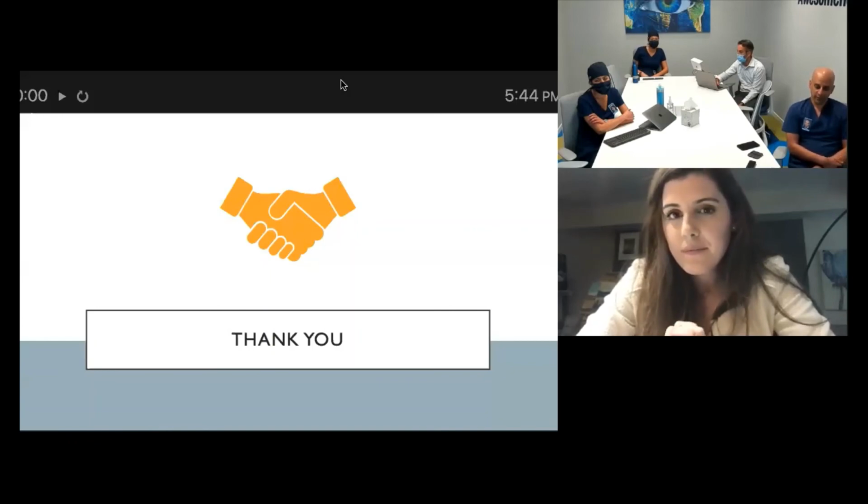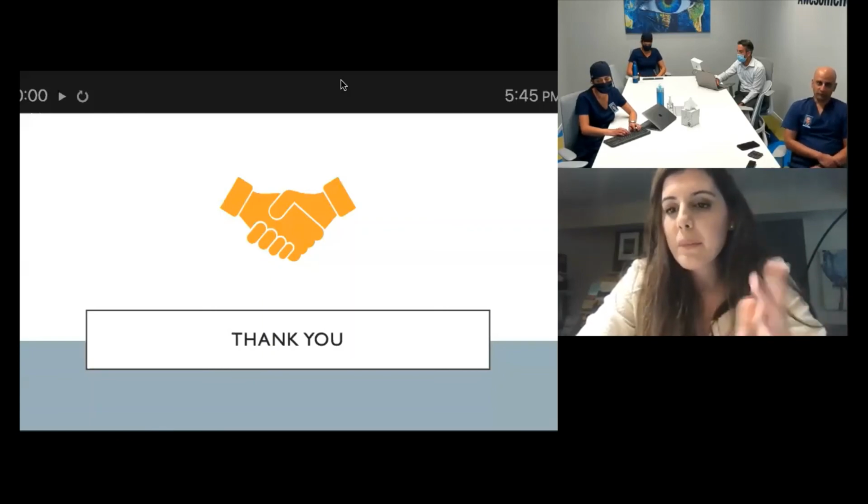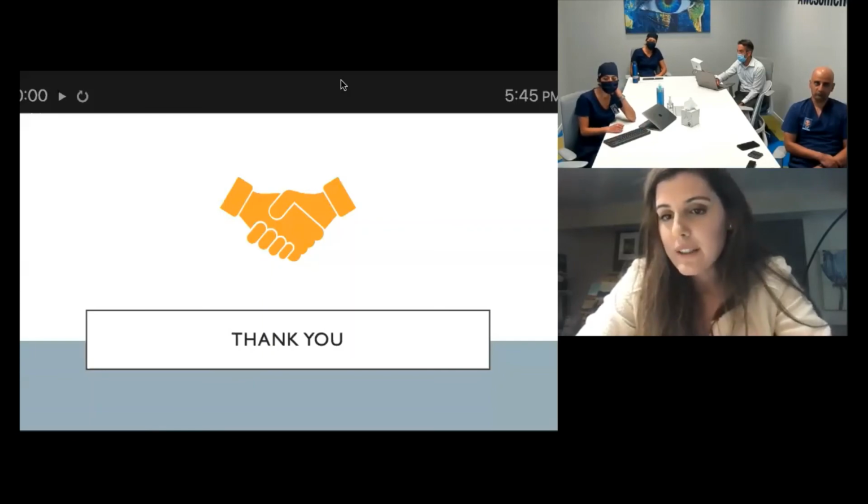Okay. And what about the lenses that are out there? It's one thing to get the diagnostics done and figure it out. I've got the diagnostic, I have an understanding of what the eye is all about. How do you make the connection with what kind of lens you'll be choosing? So basically, after you've gone through the different steps, there's only a few lenses that would be available for every patient that would actually fit the visual quality that they need. And typically availability is a big issue. Experience with the lenses is another big issue, and that doesn't mean that you won't try new lenses, but it really depends on all of the different items together, and you really need to be up to date with everything that's available out there all the time.